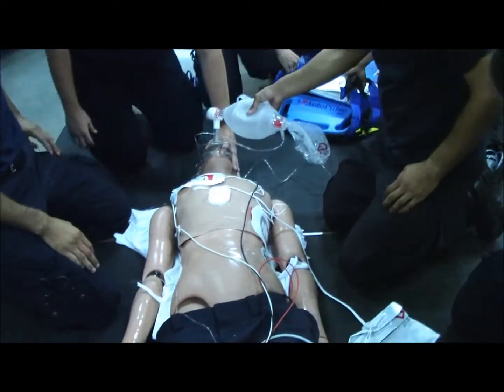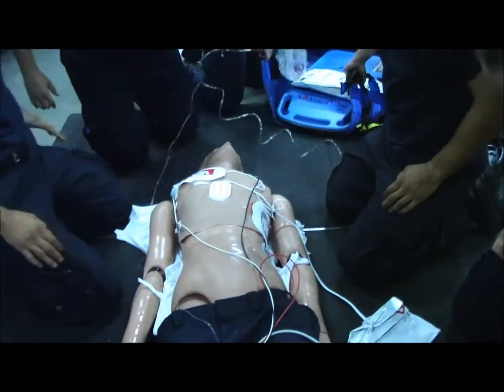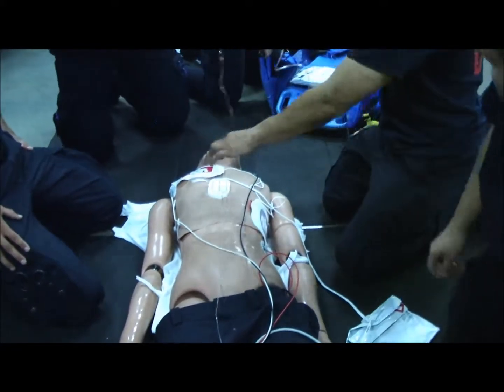Any pulse? I hit V-fib. No pulse? Clear? Shocking. Shocking. Okay. Go ahead and up.